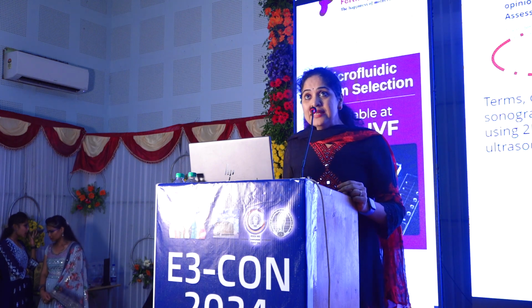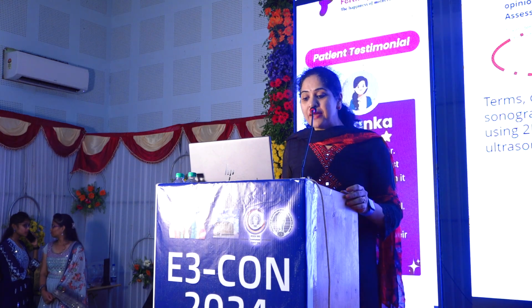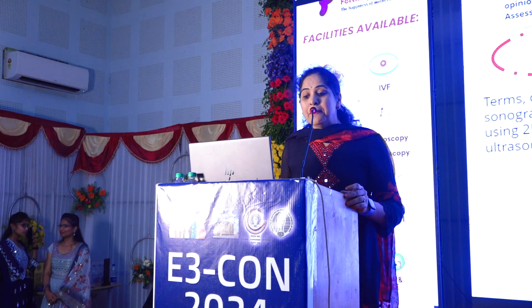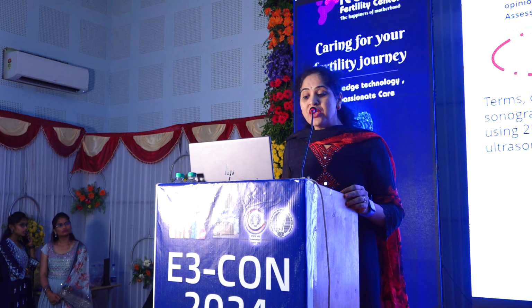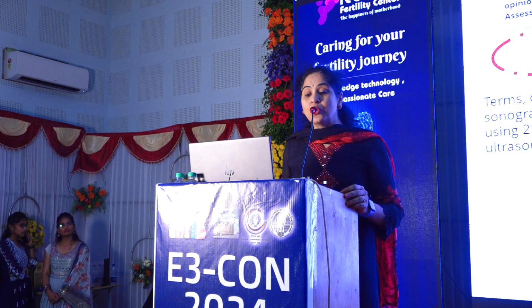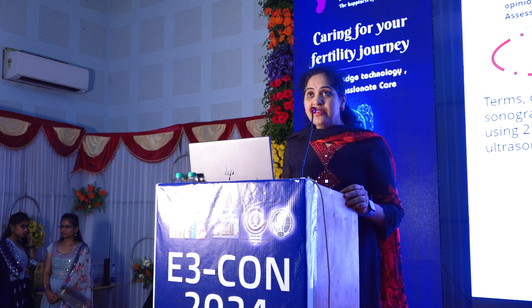The guidelines of examination of myometrium were introduced way back in 2015 as MUSA criteria, which means morphological uterus sonographic assessment. It is the terms, definitions and measurements.